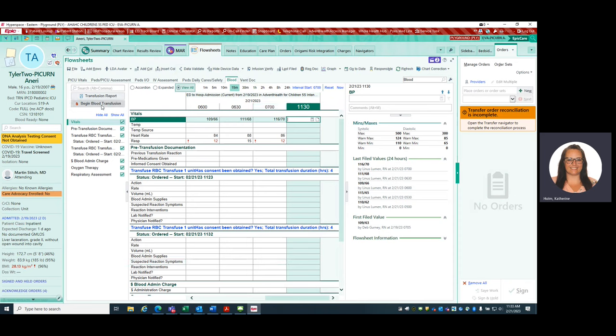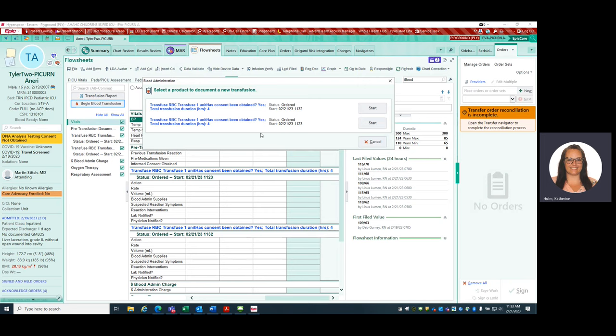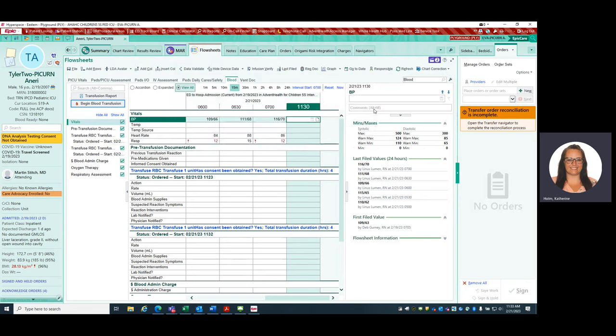To do that, you hit begin blood transfusion. It's going to have maybe two things on here. This is because I put in two different orders, trying to get the playground to cooperate. But this is the most current one that I want. This is the 1132, so I'm going to go ahead and select that and hit start. I'm going to pick my line in which I'm infusing.